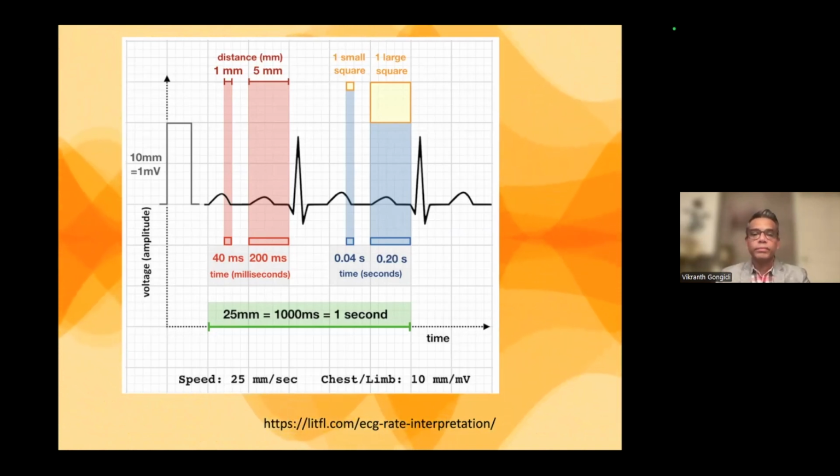We do have a question in the chat. First question, we actually have a couple now. When you first look at an EKG, which leads should we look at first after looking at rhythm and rate?